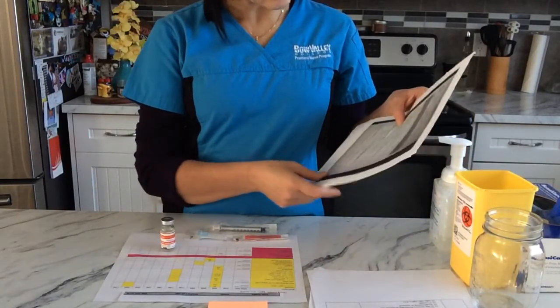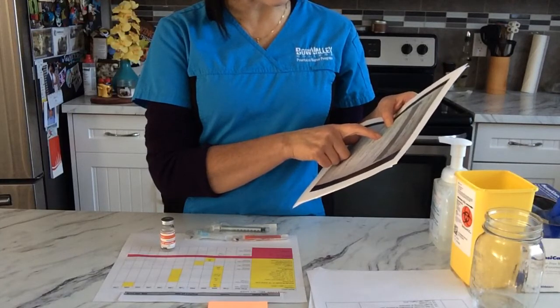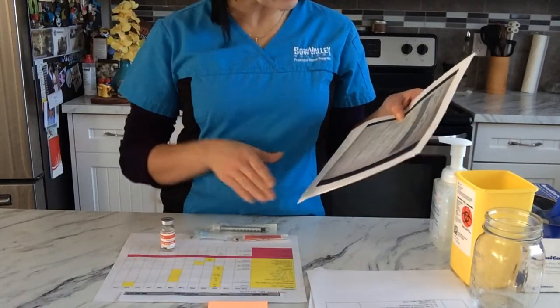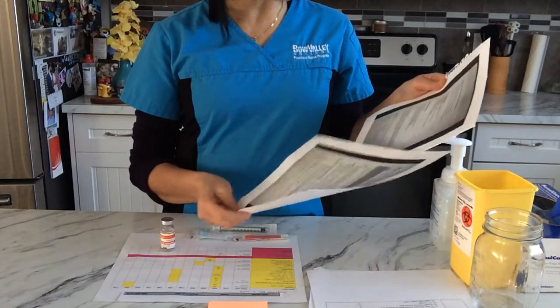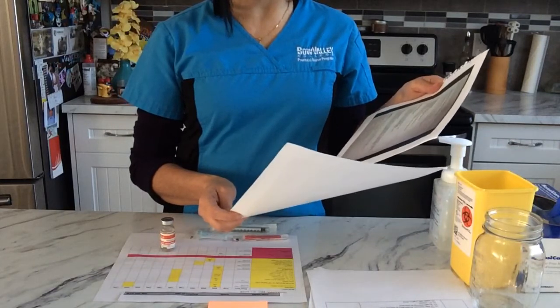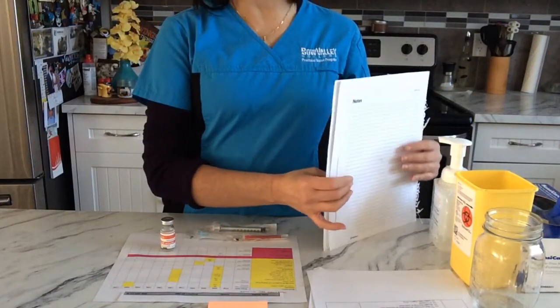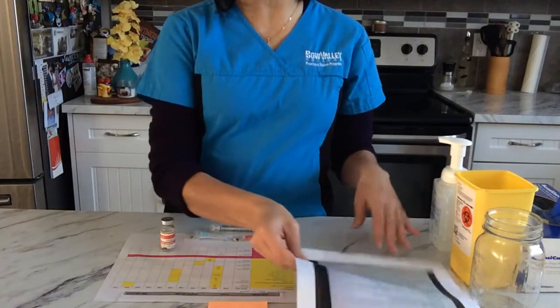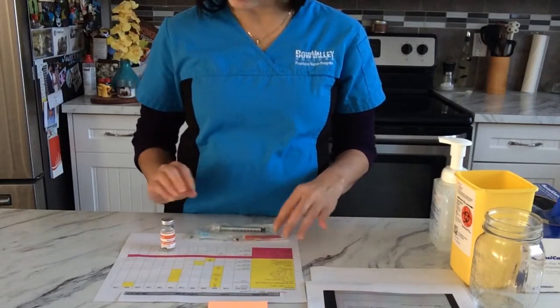The needle for subcutaneous injection is 25 gauge. That's what I have here with me. It also gives you more information about contraindications and potential hazards with this medication. I will explain to my client about heparin before I administer it.